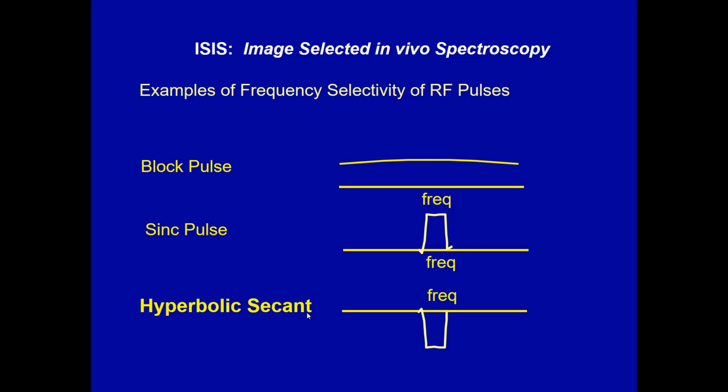So you can achieve a specific tip over a wide range of B1 amplitudes. That is useful when the B1 amplitude can be different in one part of the sample or another, that is, when a radio frequency coil applies a spatially inhomogeneous B1 field.